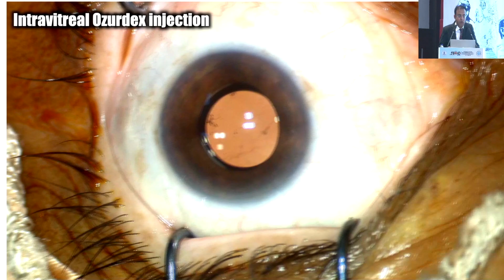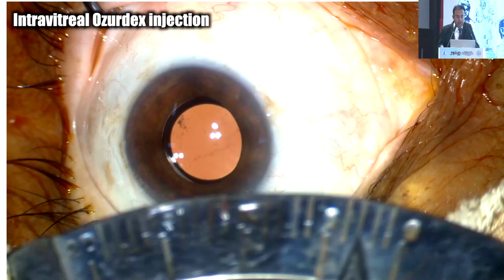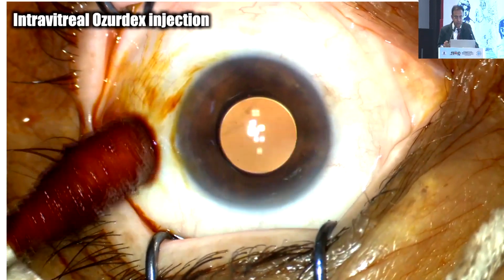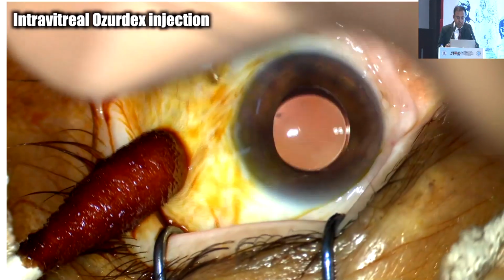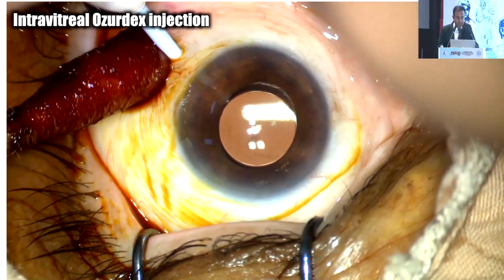Now there is one more injection, that is Ozurdex injection for chronic CMEs, chronic diabetic macular edemas. Now this is very important. 3.5 mm. If it is a pseudophakic eye, you need not worry too much about 3.5 or 3 mm, but if it is a phakic eye, your direction has to be very good and right into the center. As you can see here, we are injecting this Ozurdex.